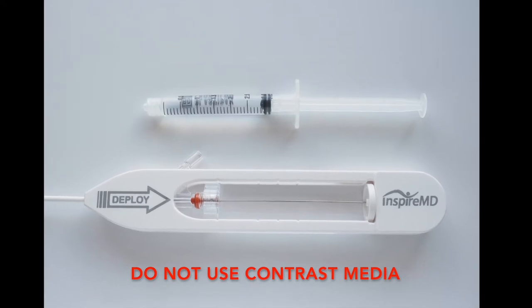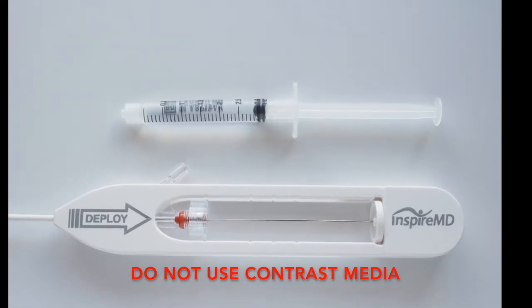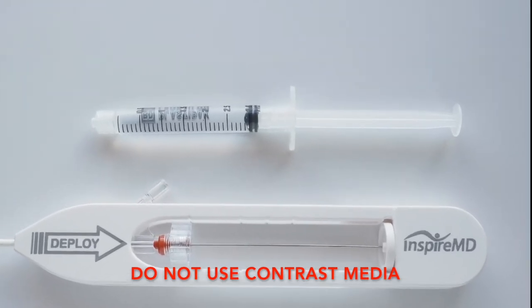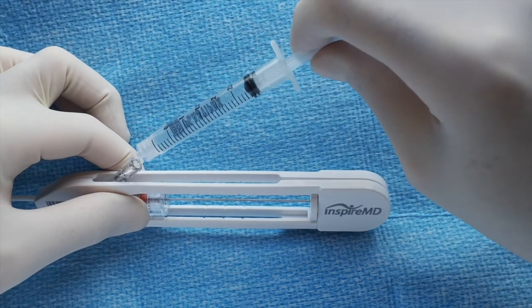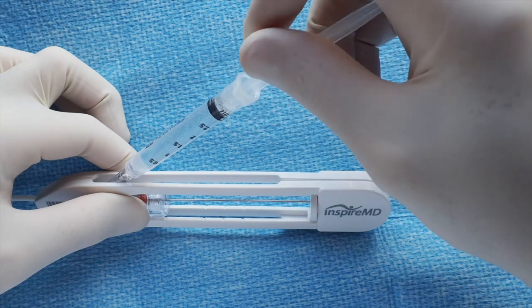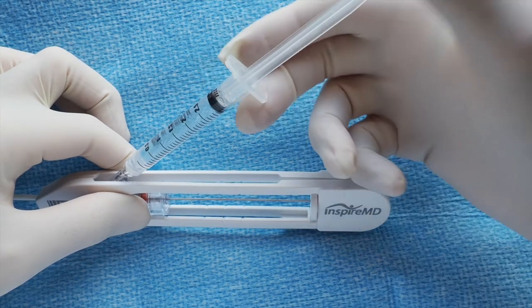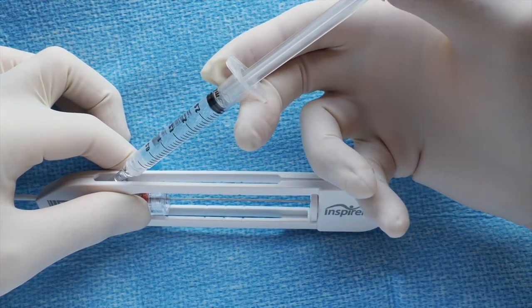For device flushing, use a 3 cubic centimeter luer lock syringe filled with heparinized saline solution. Carefully flush the system. Hold the Y-valve body, connect the syringe and hold the syringe properly for flushing.